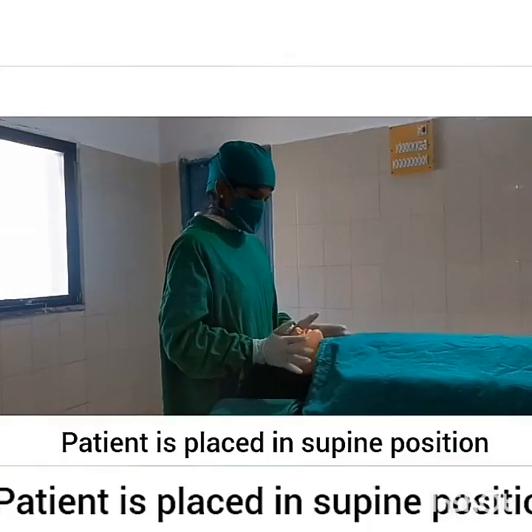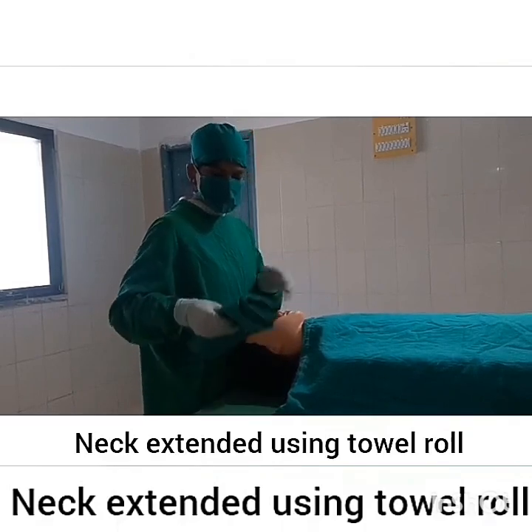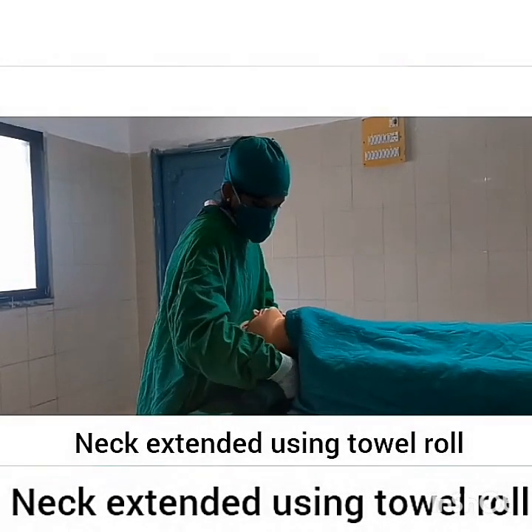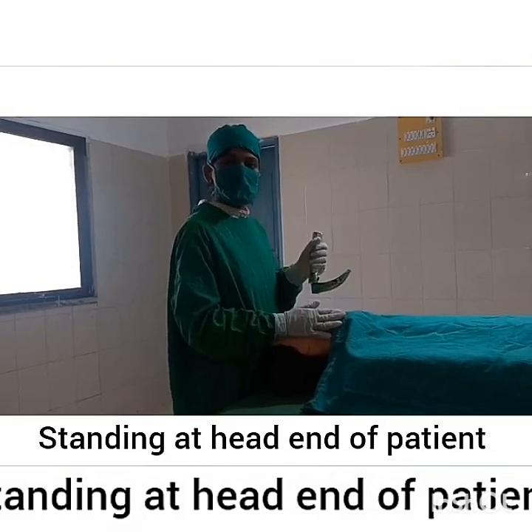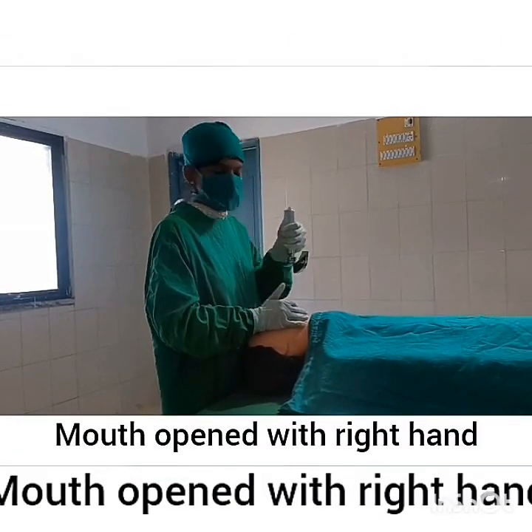Thank you. The patient is placed in supine position, standing near the head of the patient. Neck extended using the towel roll. The handle of the laryngoscope is held in the left hand and the mouth of the patient is opened with the right hand with the help of the index finger and thumb.